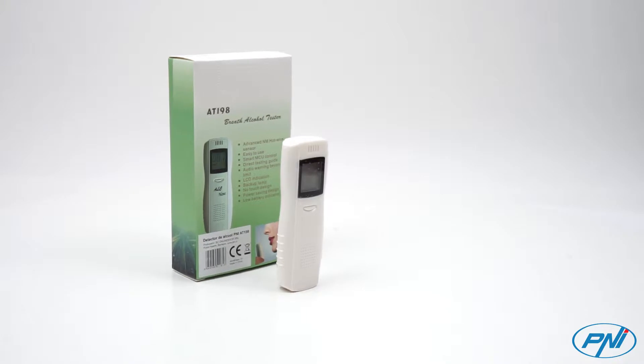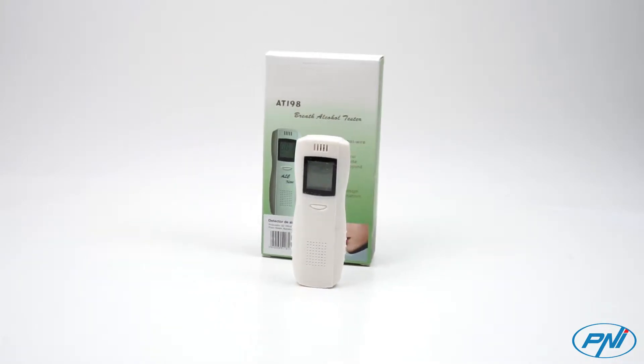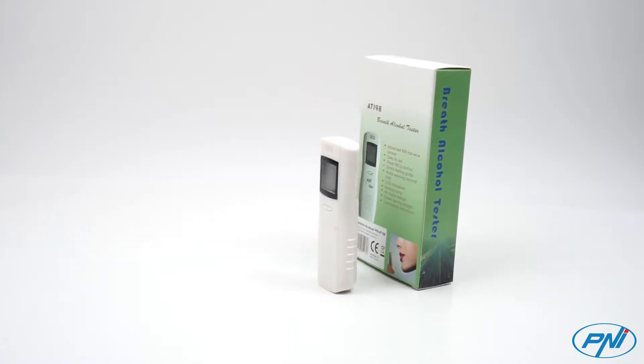Penei AT198 Breathe Alcohol Tester is a semi-professional or personal use device that provides a good estimation of the alcohol concentration in the human body.